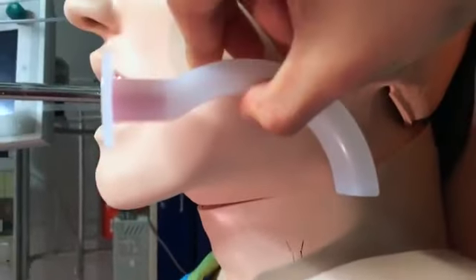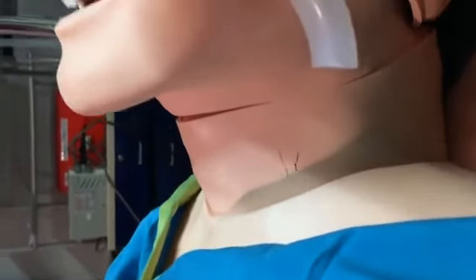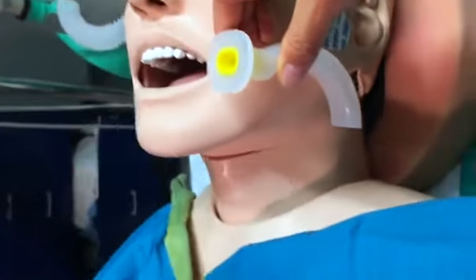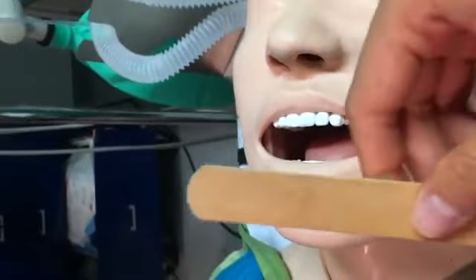Maybe I'll overcompensate for it. It's actually past the angle, so this might be a little bit too big. So I try this one. It seems to work pretty well. So I'm going to go with a 9, which is pretty average. To insert one of these, you can use a tongue blade.